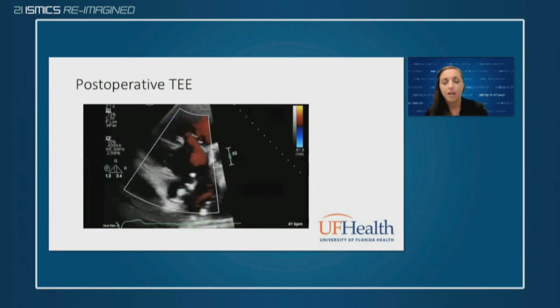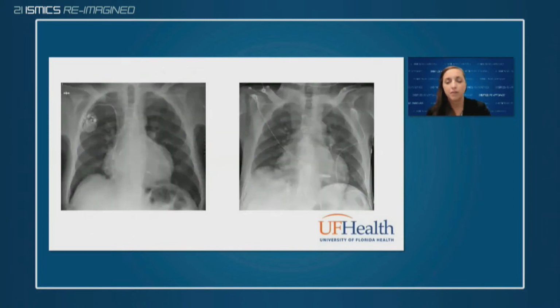Our second patient is an 84-year-old male who presented with progressive NYHA 3 symptoms that began after placement of a St. Jude pacemaker. Initially, his pacemaker and associated leads were replaced with a micro pacemaker. He returned a month later with persistent heart failure symptoms and severe TR. Given his associated comorbidities and frailty, the decision was made to pursue a palliative CAVI procedure, which was performed as previously described. He too is reporting NYHA 1 symptoms with resolution of his ascites and significant improvement in quality of life.